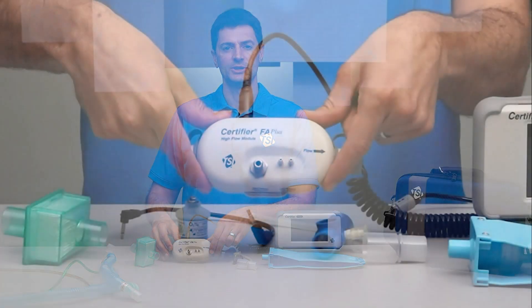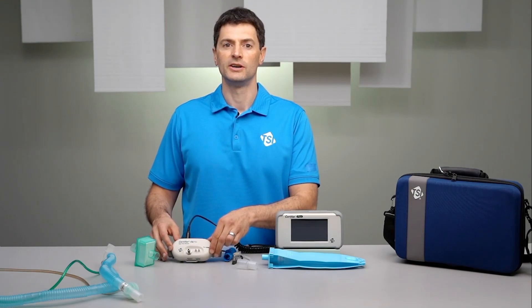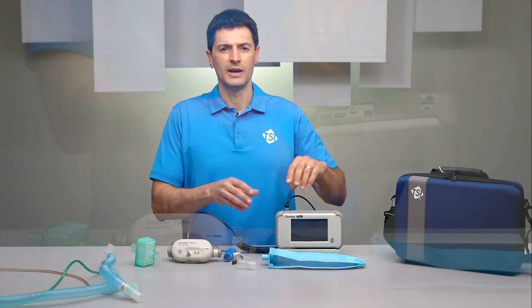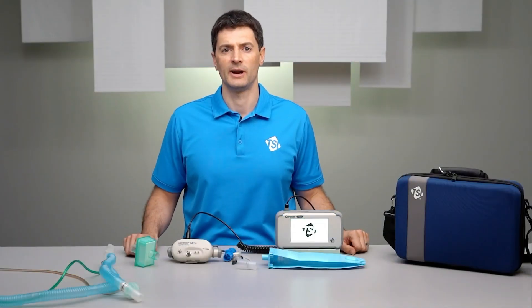The high flow module is used for testing ventilators and is capable of testing any type or model of ventilator. Connect the high flow module to the interface module using the coiled cable and then press the power button to turn the instrument on.